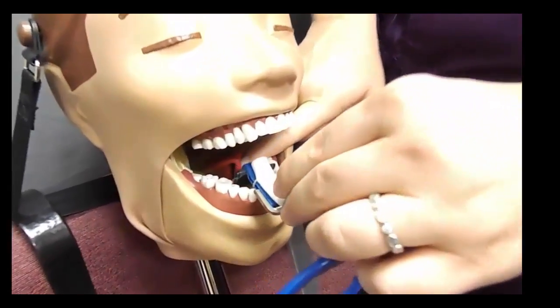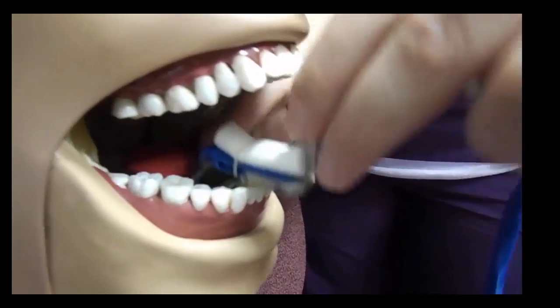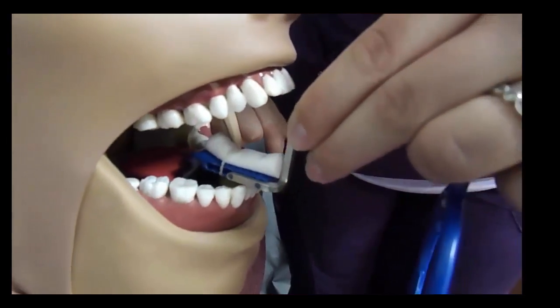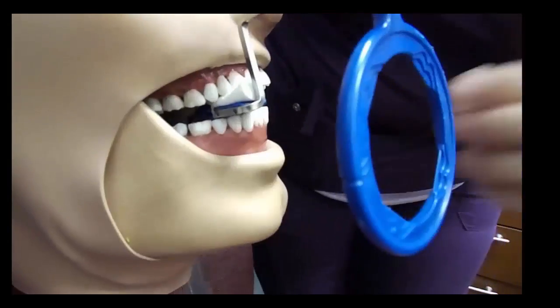When placing the instrument for the first premolar-canine in the mandible, always come in from the front of the patient's mouth, never the side. Push the bite block back against the tongue and have the incisal edges resting at the end of the bite block, then slide the bite block over to the first premolar-canine and have the patient bite down.